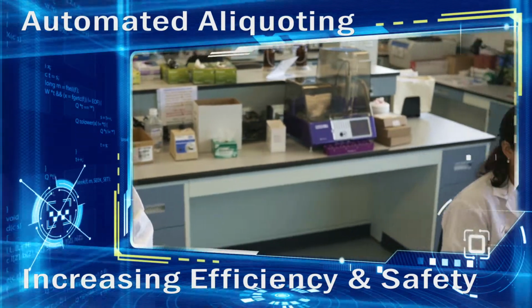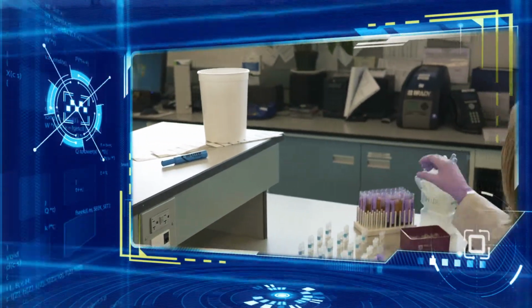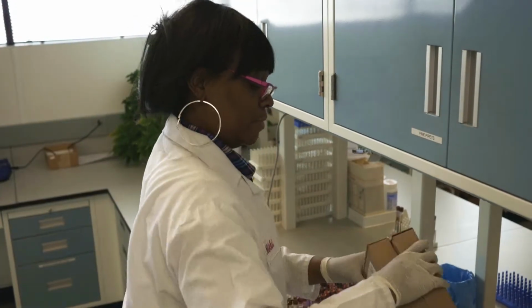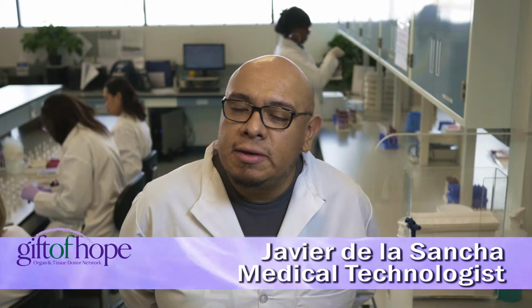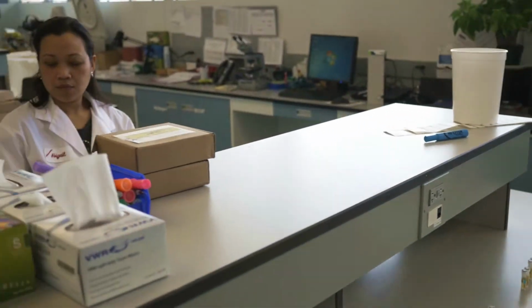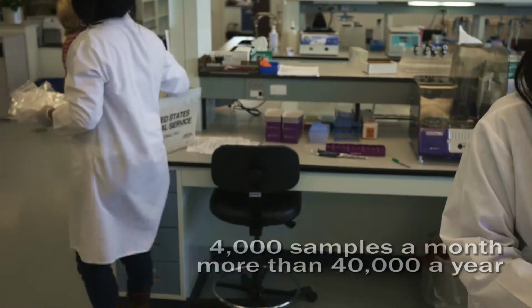The process that we are witnessing today is the sample collection of the patients that are on the transplant list. We collect samples from patients that are on the transplant list every month. There are many patients on the transplant list that are on dialysis and home dialysis care, and we do cross matches. So we could do tests with the blood of the patients with potential donors that are here in Illinois and northern Indiana. And we average around 4,000 a month, and that would be about 40,000 a year.